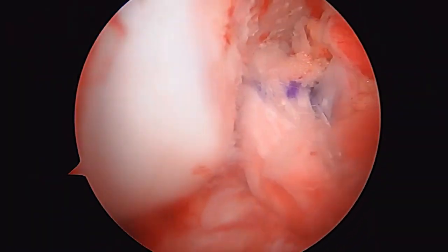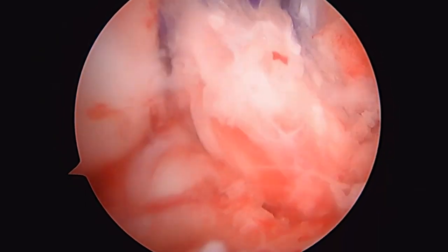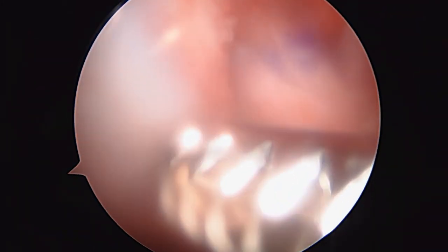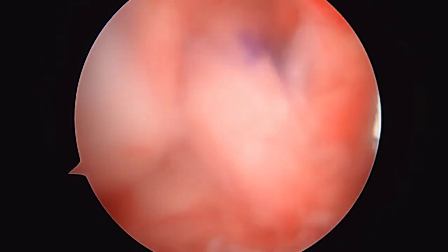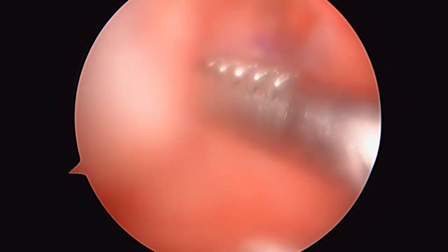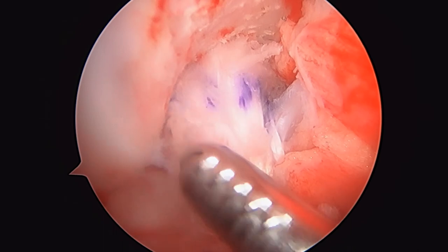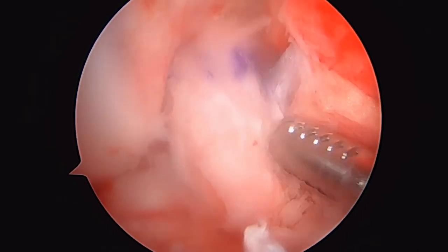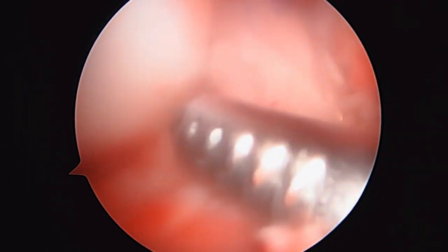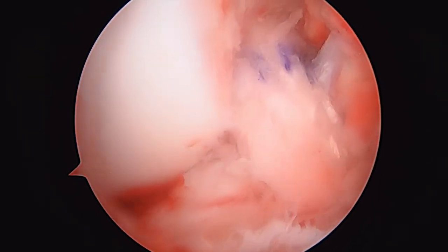The graft is in position now — it looks very good. We're just going to irrigate out the knee. That's your new graft. We still have one more thing to do: we still have our stem cell injection. We're going to pass through a 25-gauge spinal needle. Your new ACL looks very nice right there. Good luck to you.